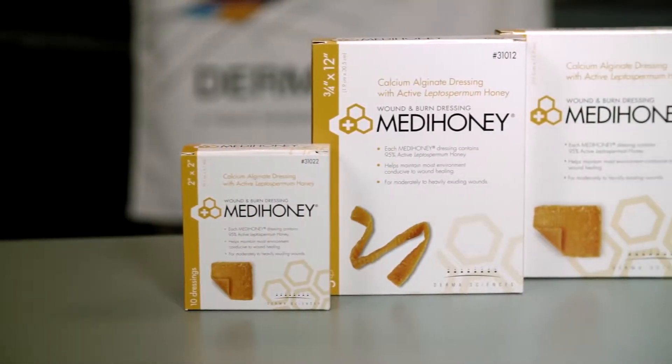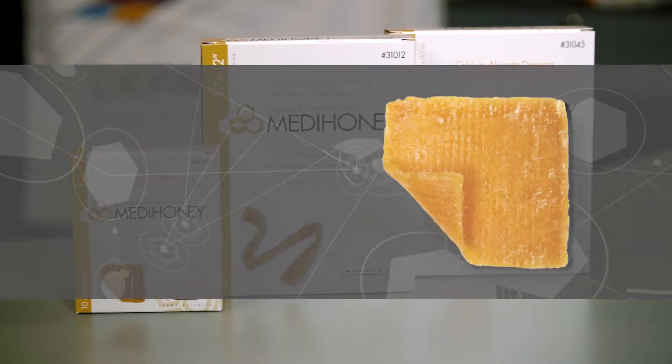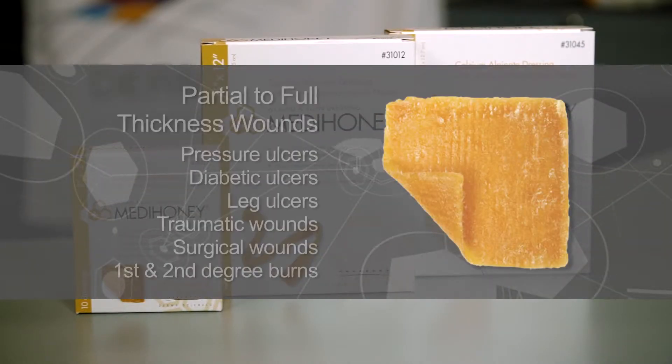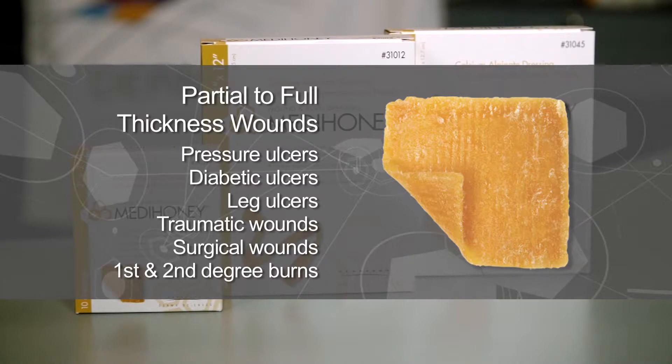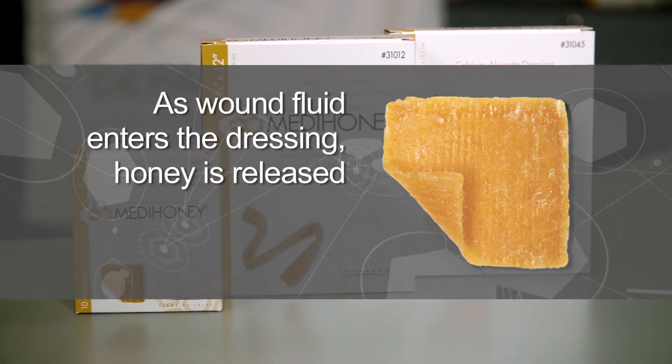The MetaHoney Calcium Alginate is active leptospermum honey impregnated into a calcium alginate dressing. These dressings are appropriate for partial to full thickness wounds and offer greater absorption capability, suitable for moderate to heavily draining wounds. As wound fluid enters the dressing and is absorbed, the honey is released into the wound bed.